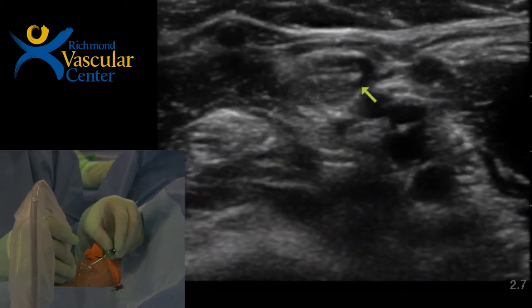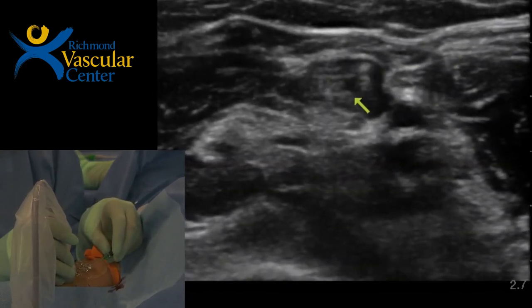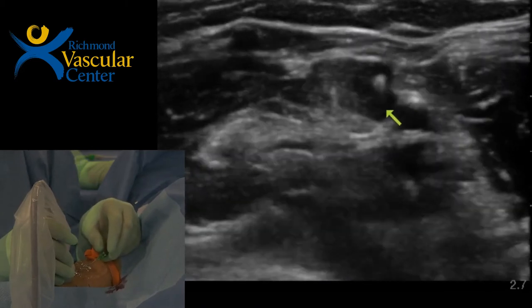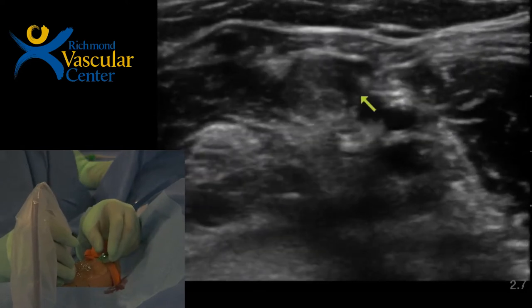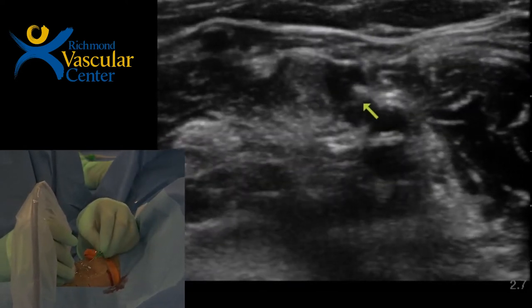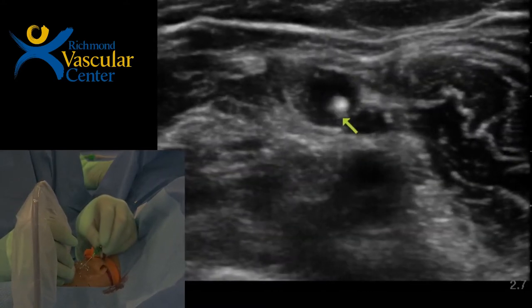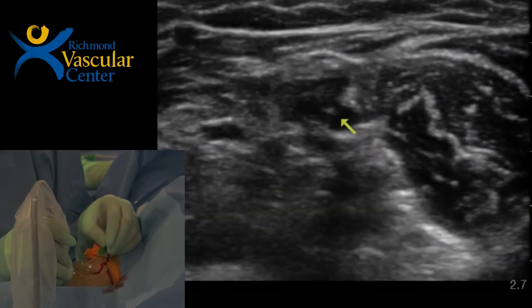So now we're coming down the perf. And I think I talked about giving myself enough room, and that's exactly what I'm talking about. By the time you actually enter these veins, especially when they're close to the skin and they're pliable, you'll have come down a centimeter or two. So you want to give yourself enough room to make that happen. And so there's our needle there. It's probably too far down.